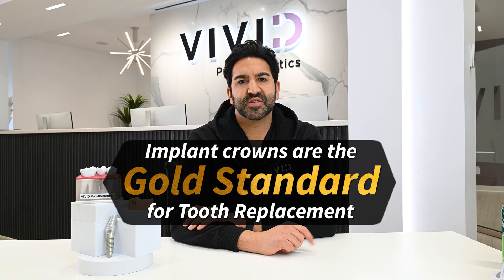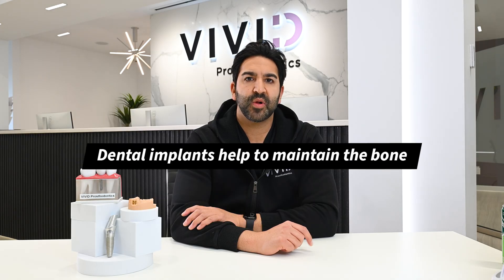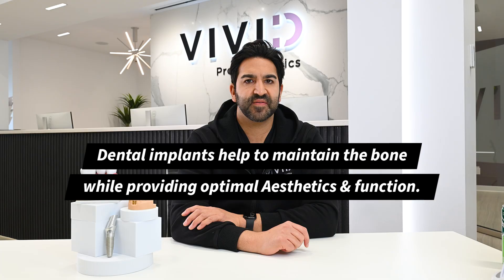Implant crowns are the gold standard for tooth replacement. Dental implants help to maintain the bone while providing optimal aesthetics and function.